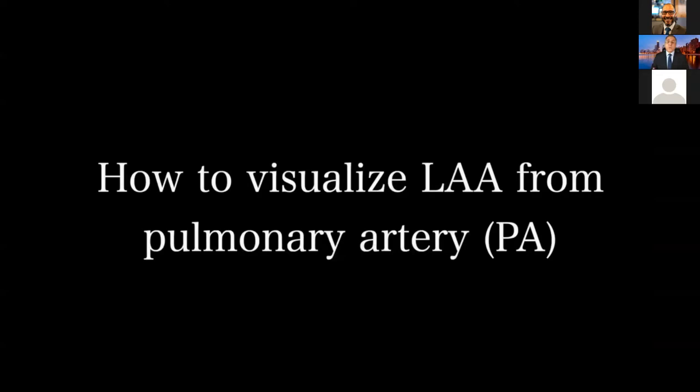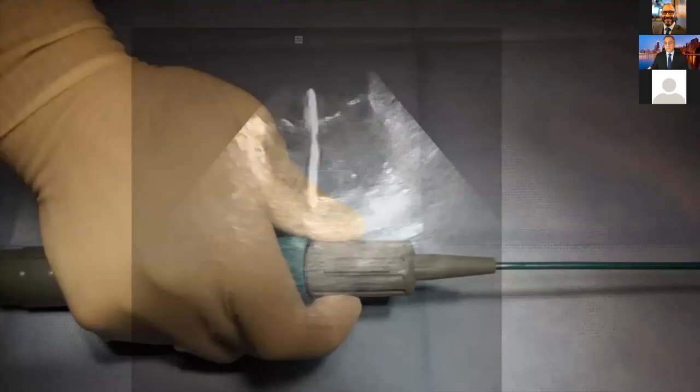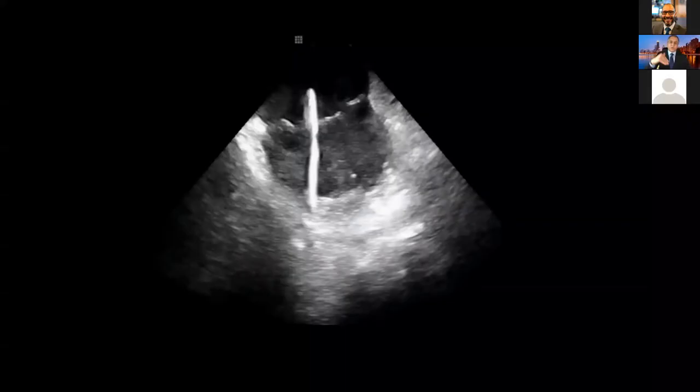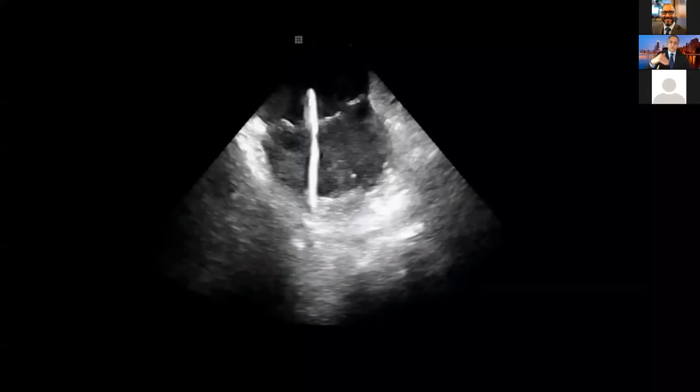Another way is from the coronary sinus. If you are inside the coronary sinus and perform a clockwise rotation of the ICE, you will be able to see the left atrial appendage. This is a more challenging view compared to the pulmonary artery approach, but it is one way to rule out thrombus. From inside the coronary sinus, you can also see the apex of the left atrial appendage, and if you counter-clock your ICE, you get a three-chamber view — left atrium, left ventricle, and right ventricle.